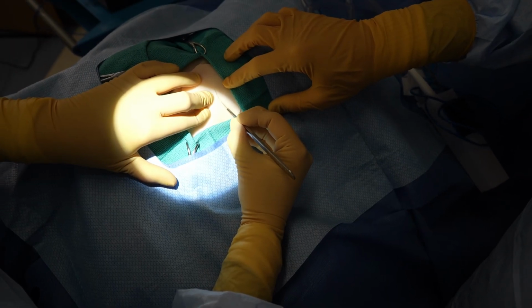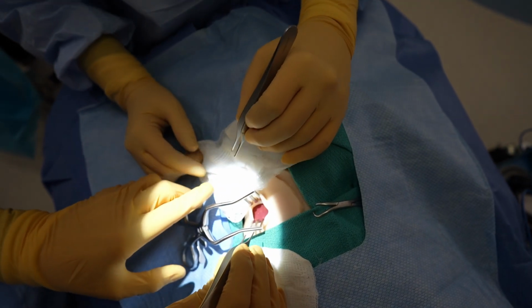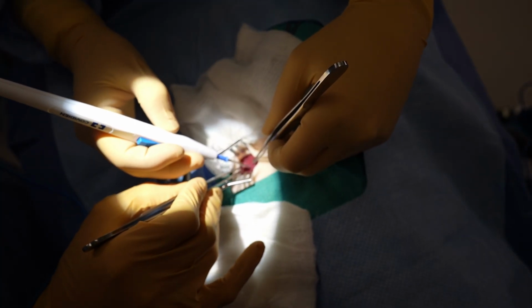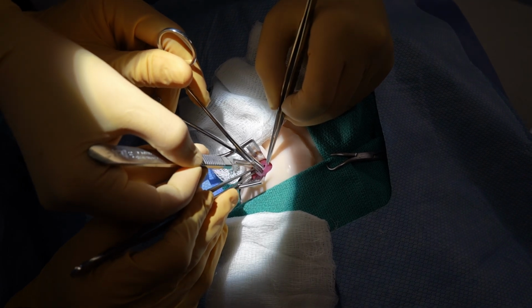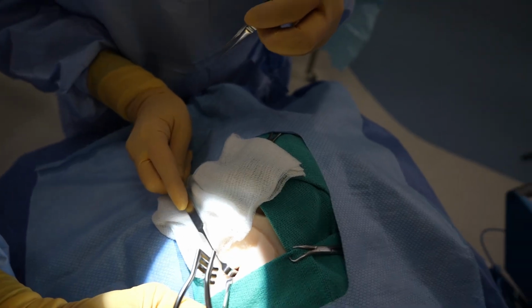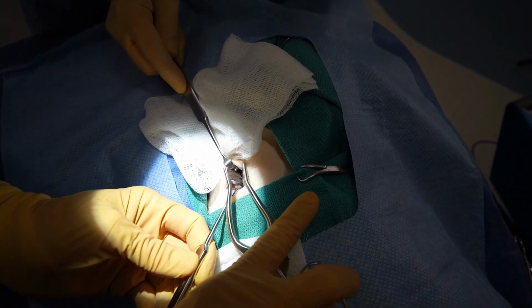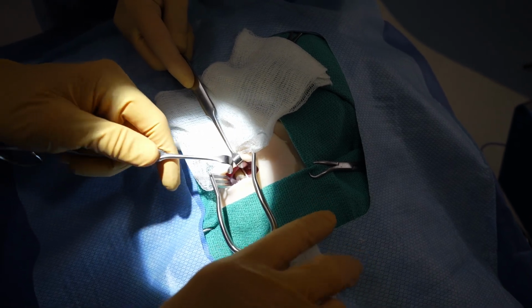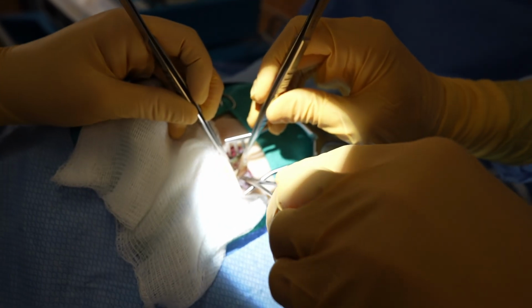We make our incision 1 finger breadth above the clavicle and dissect down to the subcutaneous tissue. We then identify the sternocleidomastoid muscle and separate the two bellies of the muscle vertically in order to identify the carotid sheath underneath. We will use a combination of blunt dissection and electrocautery for this portion of the procedure. It is useful to have a self-retaining retractor in order to help you better visualize the carotid sheath underneath. Now we can see the jugular vein and vagus nerve.